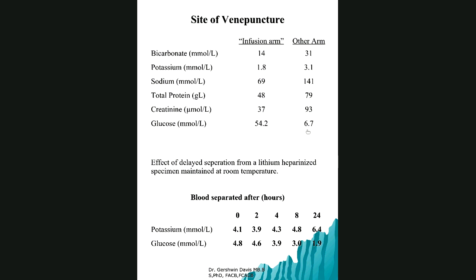And you want to feel sorry for the patient and take blood from the infusion and you get the wrong results. You need to use the other arm. That's the message. You can't take it from there because you might get this dilution effect, falsely elevating based on what is being infused.